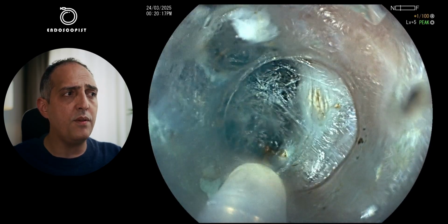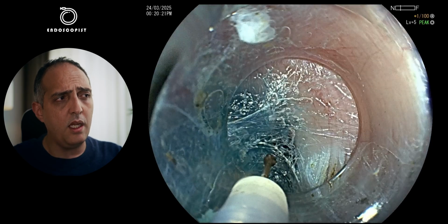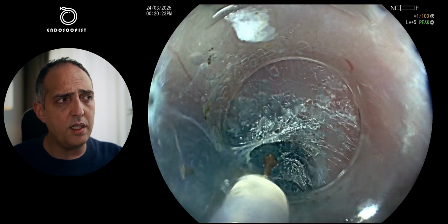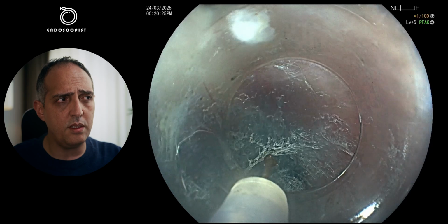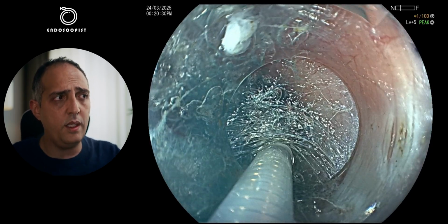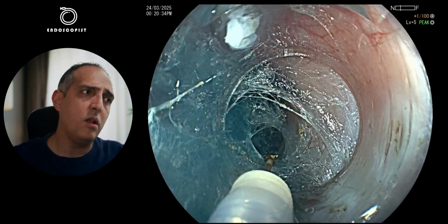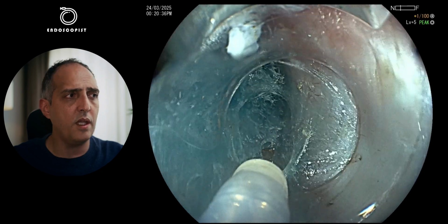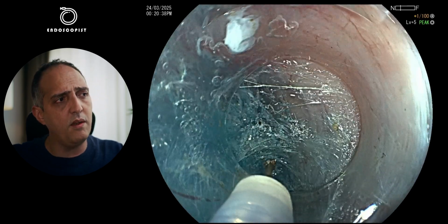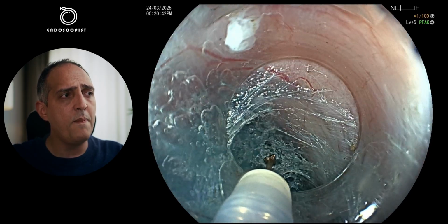Again, I'm keeping myself near to the muscle layer. You can see here the muscle fibers. Sometimes you can injure the muscle fibers during this process, but it's not a problem because we will cut them open at the end anyway. But the very important thing is to keep the mucosa intact during the whole process, not to have a perforation, of course, at the end. So again, keep yourself as near as you can to the muscle layer.